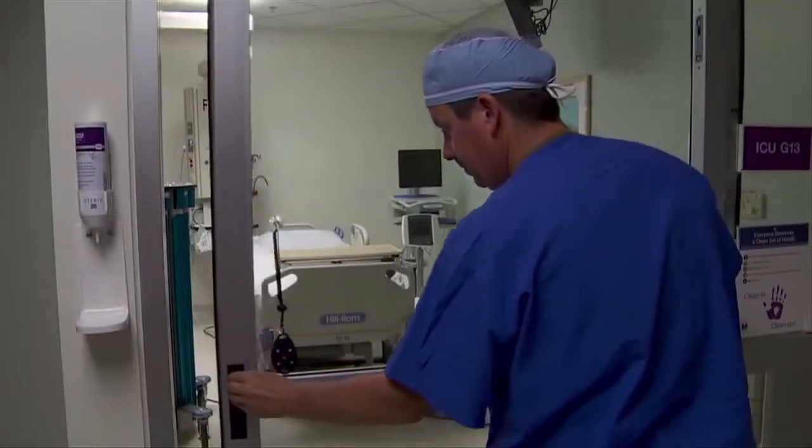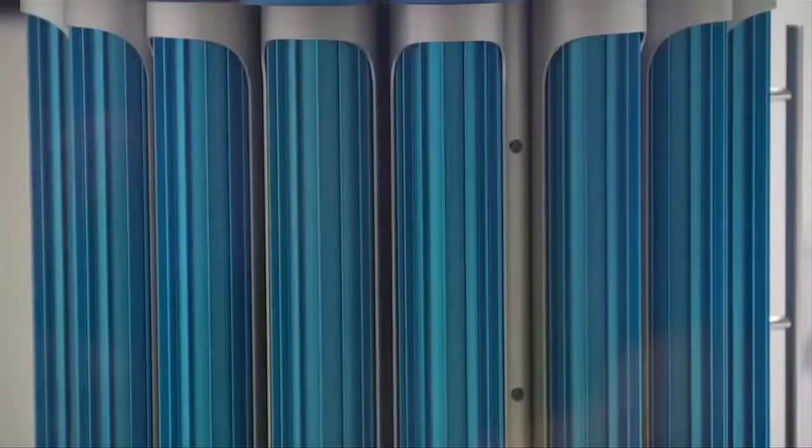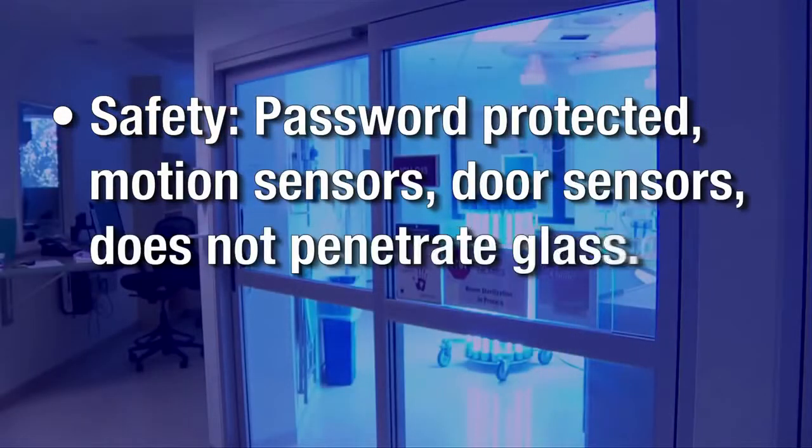And finally, there are numerous safety features in place with the IRIS system. IRIS only works in a locked room and turns off if it senses motion. The units are password protected, contain motion sensors and door sensors, and the UV light does not penetrate glass.